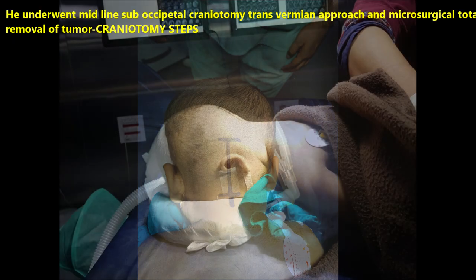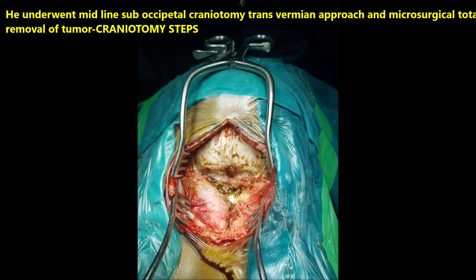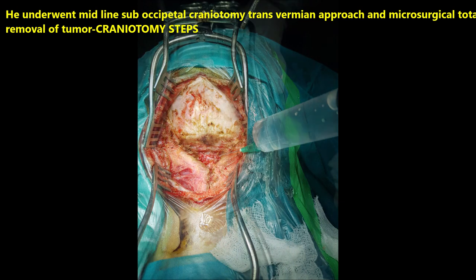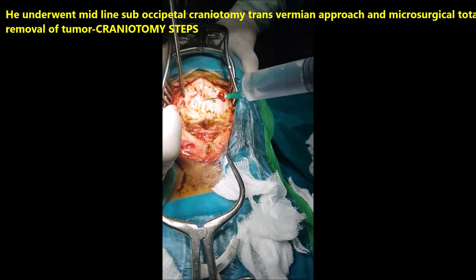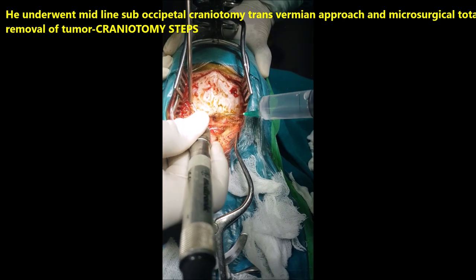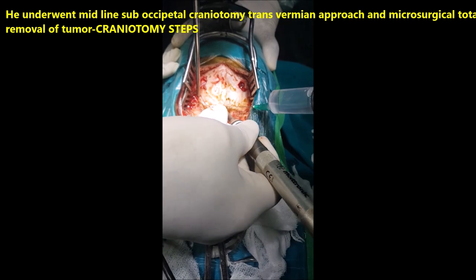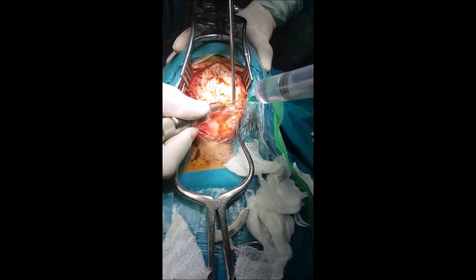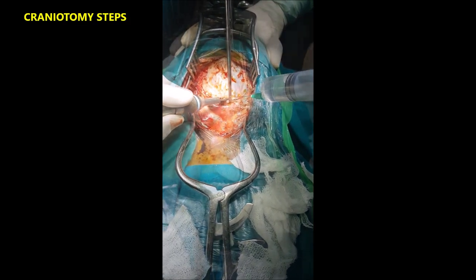He was taken up for surgery since he was in poor neurological status with altered sensorium and not accepting feeds. First, we decided to put a shunt to improve his general condition and sensorium. He underwent right ventriculoperitoneal shunt, and after three days was taken up for major surgery: midline suboccipital craniotomy and transvermian approach, with microsurgical total excision of the lesion.